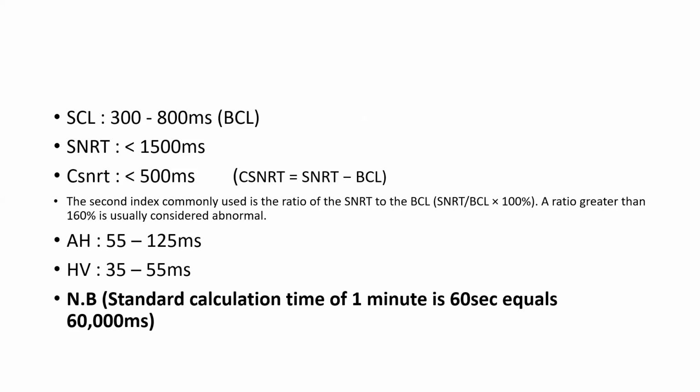For example, a patient's SA node rate can run between 60 to 100, right? So if we start pacing the atrium at 150 beats per minute, you will know that the SA node will not run faster than that, so you can suppress the SA node. You can as well pace it at 200 beats per minute and suppress the SA node. Now, after you stop pacing the atrium, you would expect that the SA node should recover its pacemaker function, right?